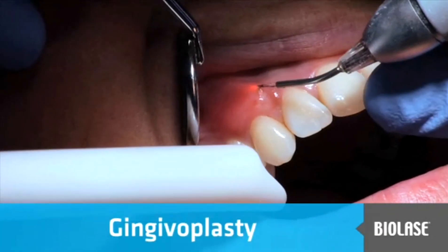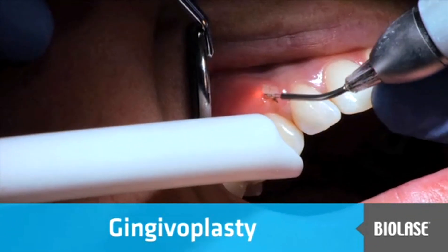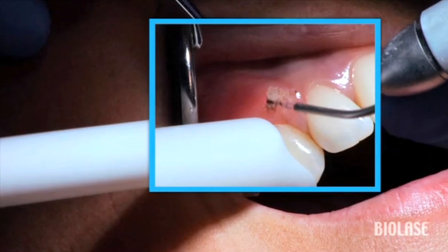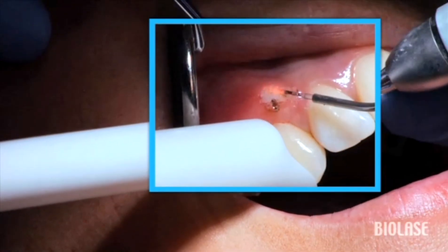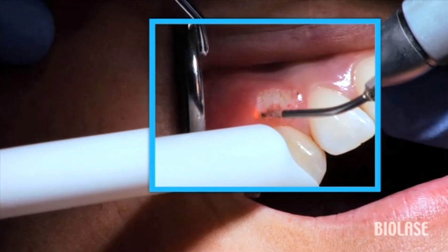This patient had a gingival graft placed in the upper right canine area several years prior. The tissue was thicker compared to tooth number 11 and she was not happy with the bulky appearance. This is an easy procedure for the EyeLase, similar to treating a patient with gingival hyperplasia.